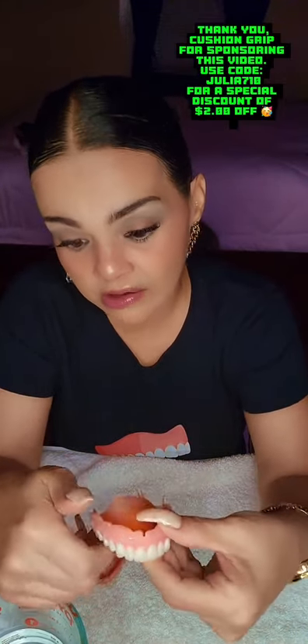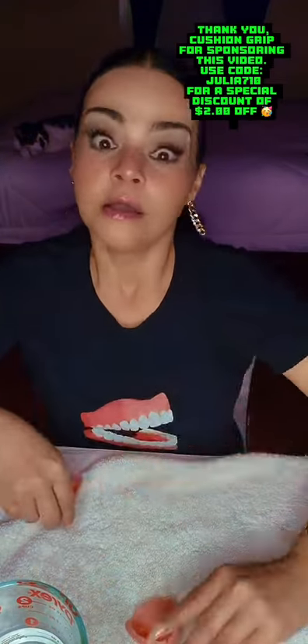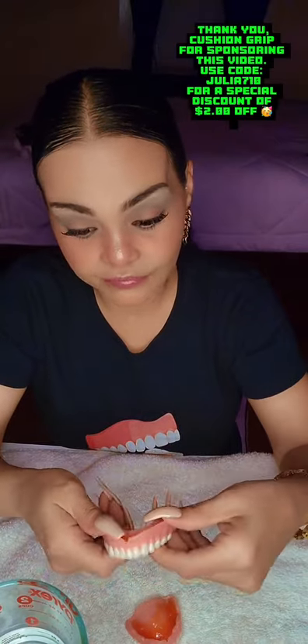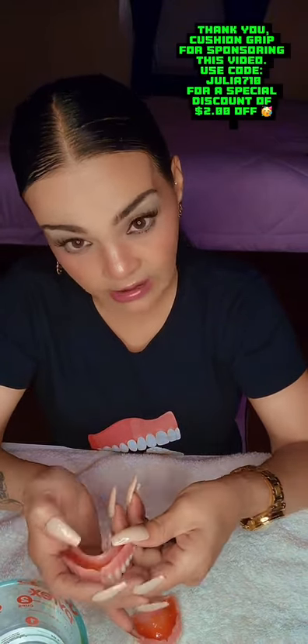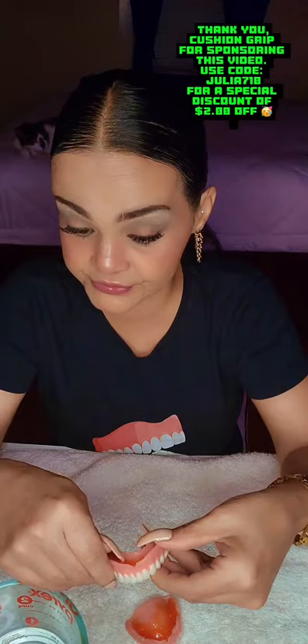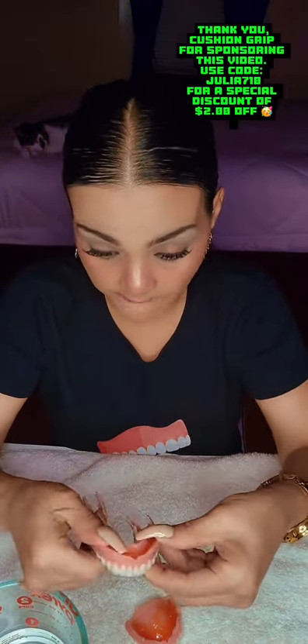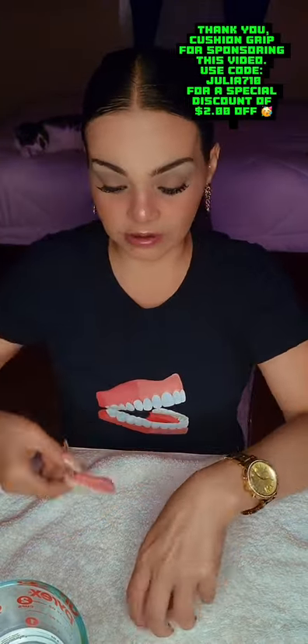Remember, as denture wearers, we're never going to have a tight denture fit. If you do, child you are blessed. We're never going to have a really tight fit — we'll get a fit, but not a tight-tight fit where we don't need help or products. If you are navigating your dentures without any products or adhesives and just wearing that hard acrylic with nothing, kudos to you. But me — I can't. I'm still shrinking. I'm 20 months post-op. So we're going to pop them in and see how this goes.